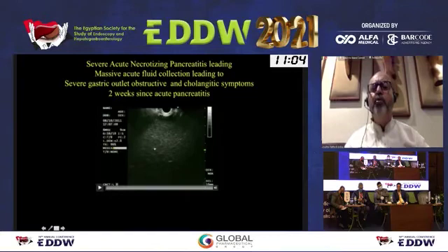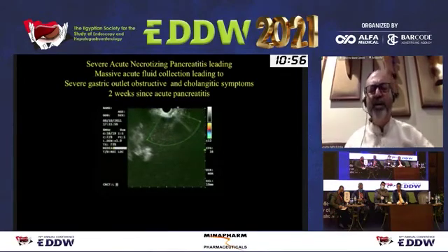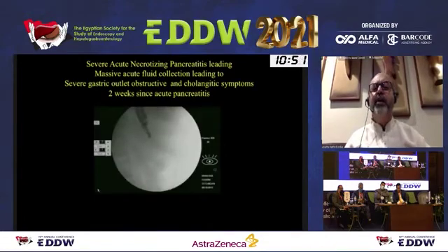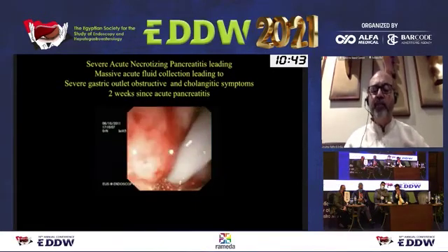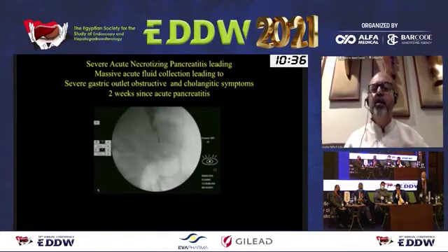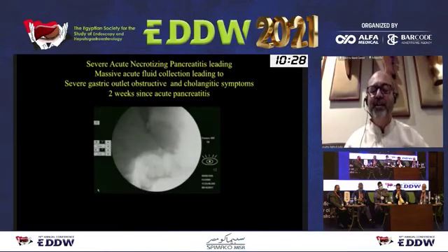Coming from there to acute severe pancreatitis with a fluid collection which is less than 2 weeks old. Now, this is a highly debatable area. I'm sure all of you would agree that we always give a timeline: you need to wait for 4 weeks or 6 weeks before the wall matures. But I'll tell you the trick here. This is almost a decade ago, we did this case, and it's a huge fluid collection. Look at the kind of wire inside the cavity, and the patient was just not thriving or tolerating anything. So the best technique to do this is do not dilate it.